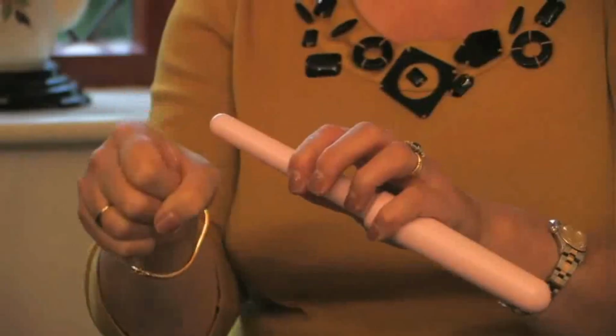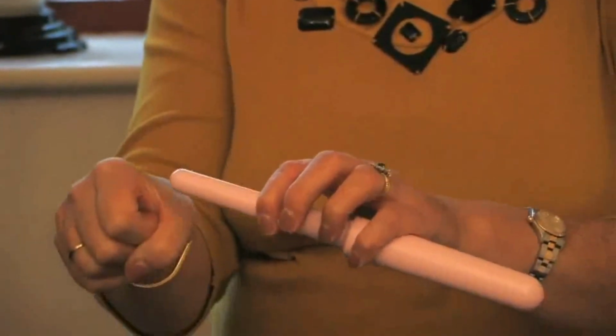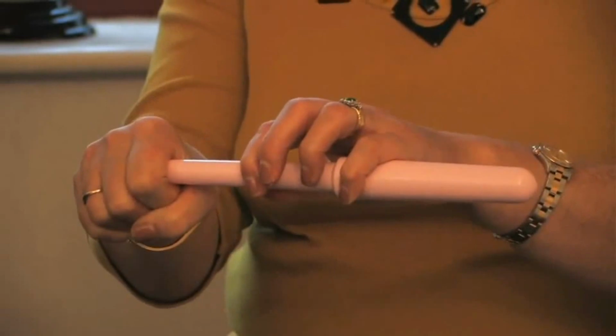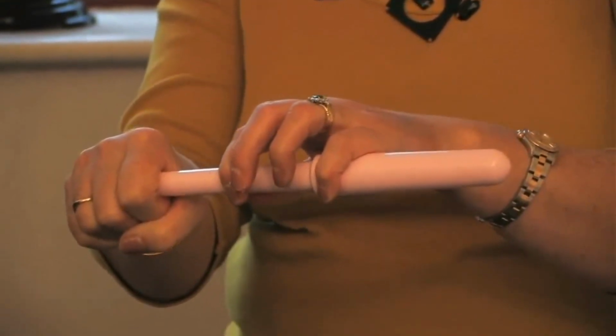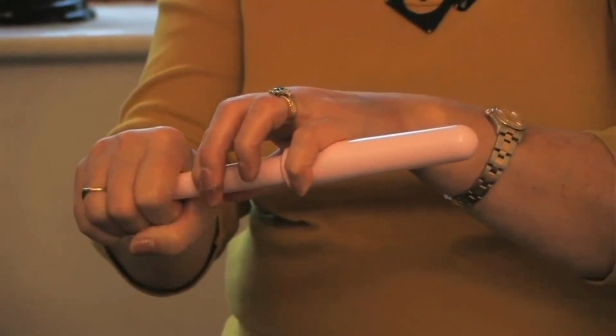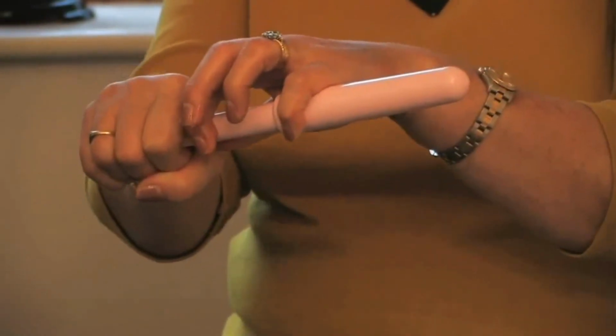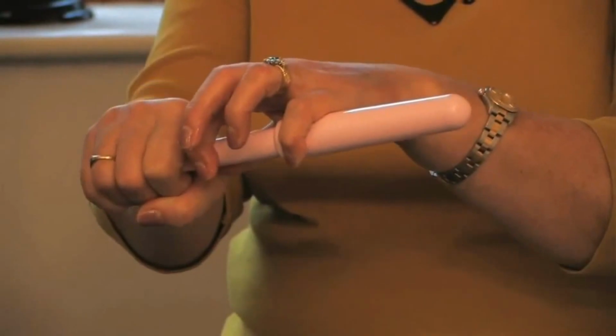Now the idea is to take a deep breath in and then let the pelvic floor relax and offer the trainer up to the vagina. And if you're nice and relaxed, the trainer should slip just easily in. And then hold it there, take a deep breath, and let the pelvic floor relax again.